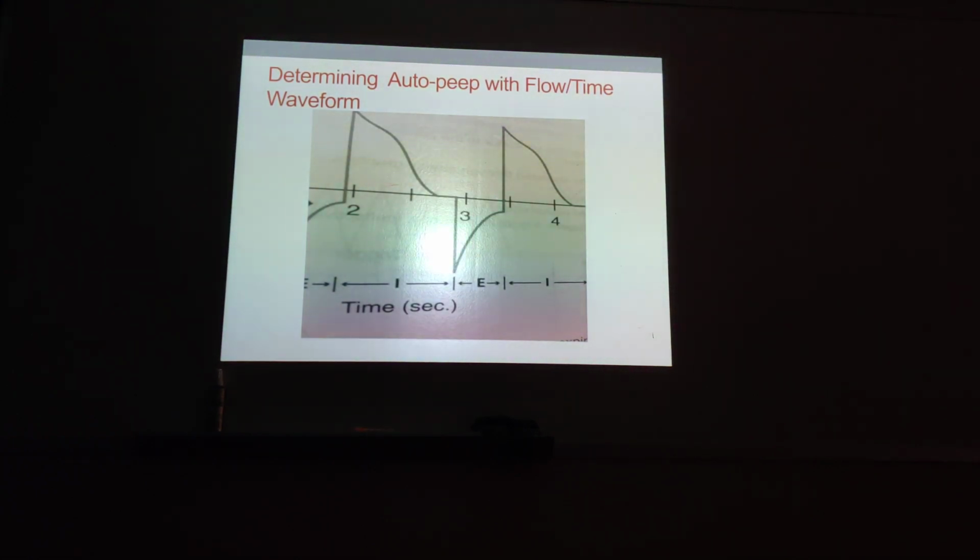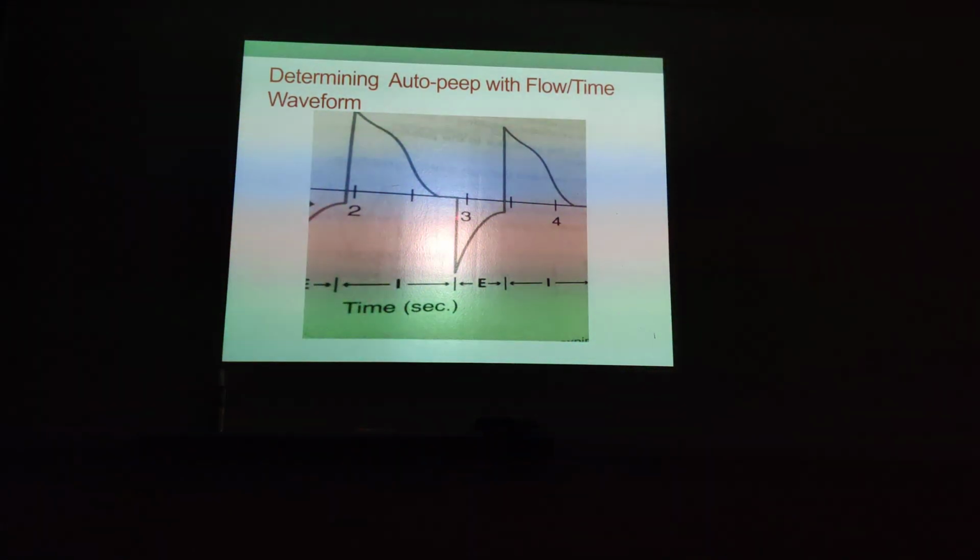Okay, so the same thing here. You can see that here, the expiratory flow did not return back to baseline before the next inspiration. So this patient is doing air trapping, okay?